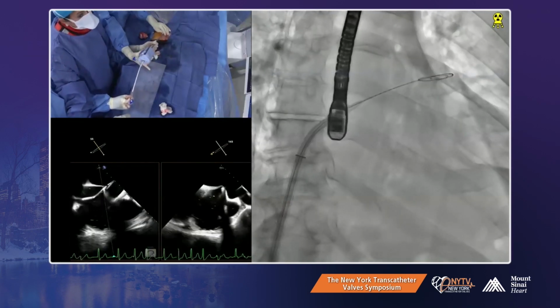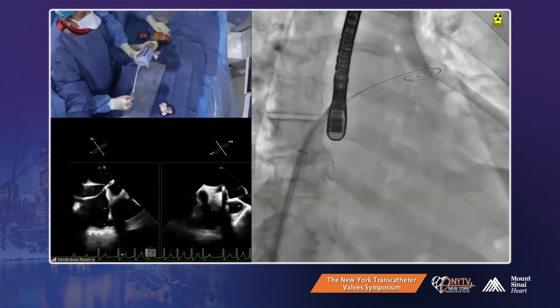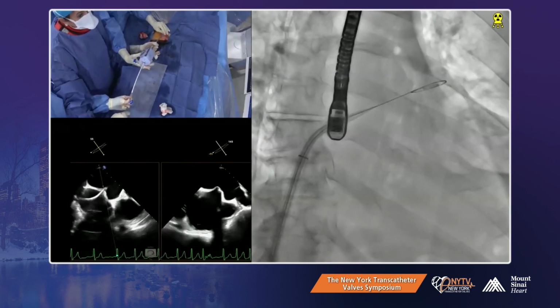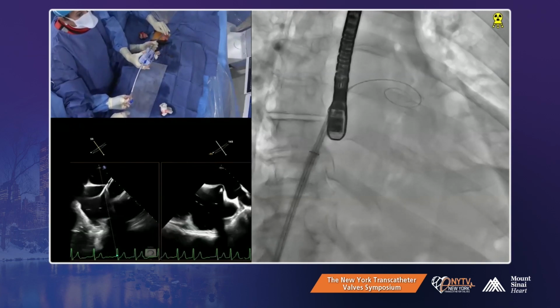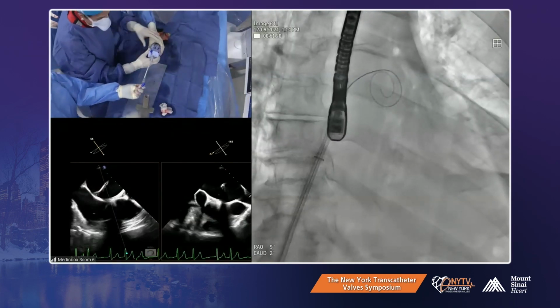The only question is, in functional MR patients, I usually use NT or actually NTW. But I agree with the choice of doing XT because this is good. Okay, the posterior leaflet is quite large, right? Yeah, it's like 1.8 centimeters.